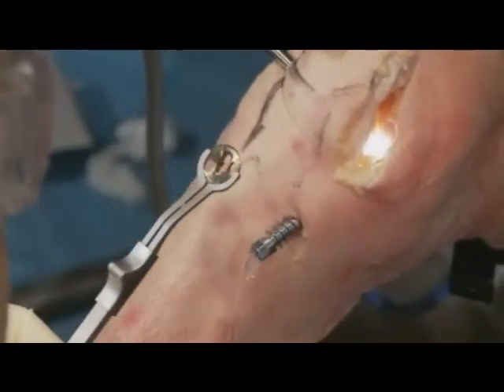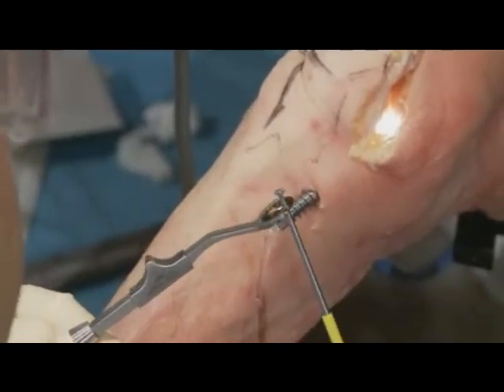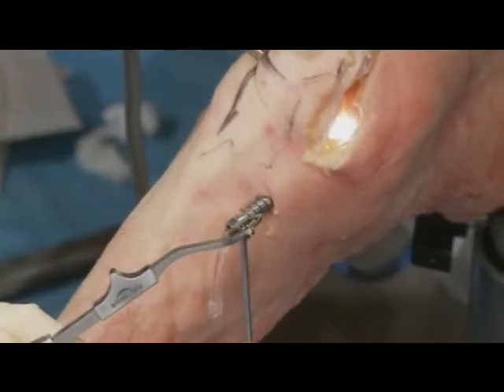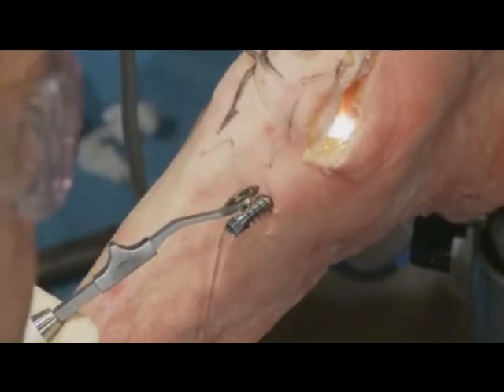Just hold the scope here for a second so I can show the idea. This is going to get connected in the joint, and what we do is we put the rod up and we put it through, and then we connect it so that our universal joint catches, and then we pull back and it cuts in a retrograde manner. So let's get that portion done.